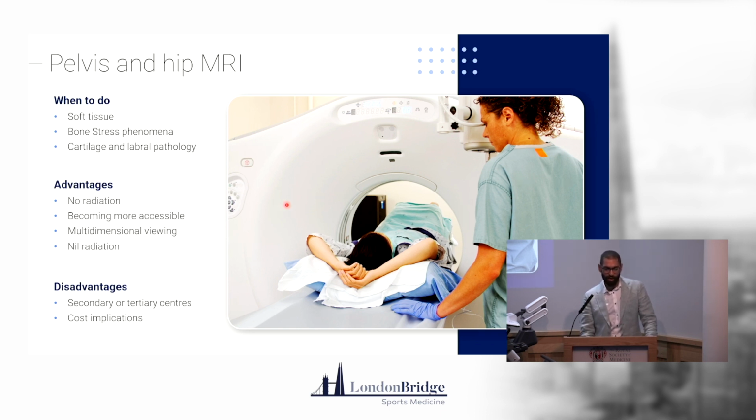There's no radiation. It's becoming way more accessible now, so I imagine most of us will have access to MRI in some form. It's multi-dimensional, so lots of different viewing angles, as opposed to X-ray, where you can obviously ask for different views, but MRI tends to give you a bit more clarity. It can still cost a little amount, particularly for NHS budgets or self-funding patients, or patients who are trying to pay for their own investigation, for example. It's usually found in more secondary and tertiary centres, so primary care practitioners may not be as exposed to accessing MRI.